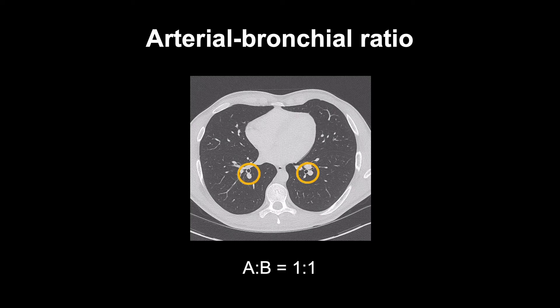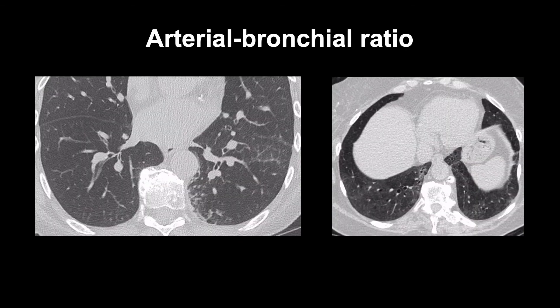The diameter of the artery and the accompanying bronchus should be about the same — this is called the arterial-bronchial ratio. It is very useful in evaluating the pulmonary vasculature, since the bronchus, made of cartilage, doesn't change size with increased pulmonary vascular pressures, while the artery does. Normally the ratio is 1 to 1, with arteries being a bit larger in the dependent lung and a bit smaller in the non-dependent lung due to gravity. If the artery is larger than the bronchus, it's a sign of increased vascular pressure. If the bronchus is larger than the artery, assuming normal vascular pressures, it may indicate bronchiectasis.